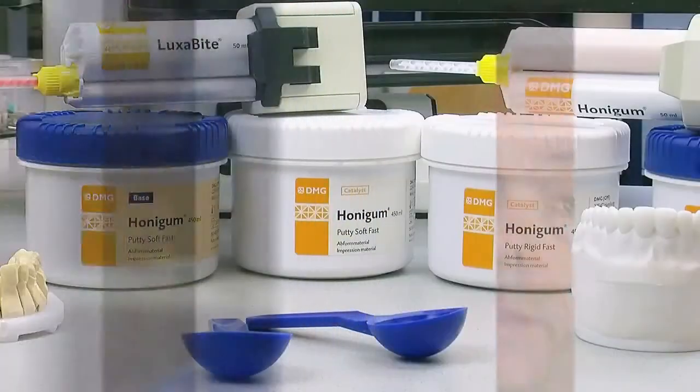What we're going to show you today is when the case is delivered from the practice to the laboratory, the processes that we use in our lab to transmit the data onto our working casts. The products that we love to use in this lab are DMG products.